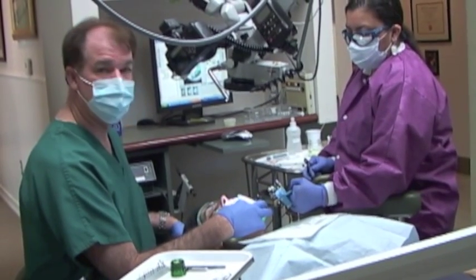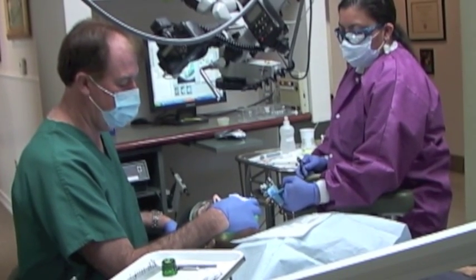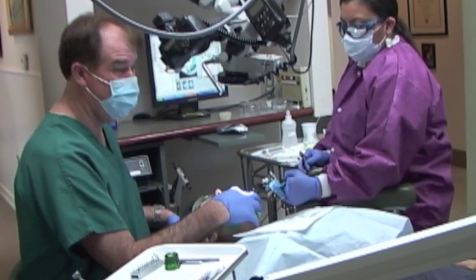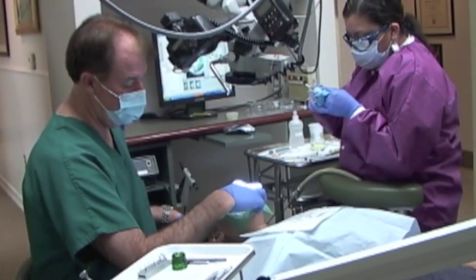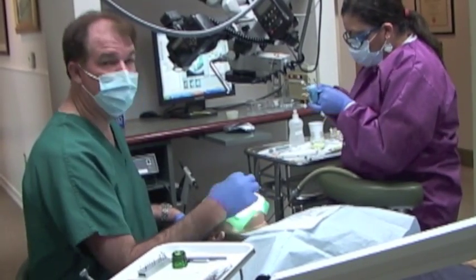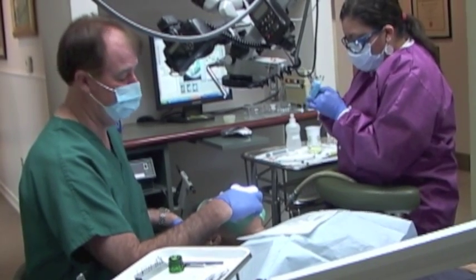I'm just teasing it with little rotational movements, very passively. Now I'm doing a filing motion, backing out over the bump, smoothing the bump. It happens to feel like it's about a millimeter from the tip. Now with the 25, same thing — it kind of goes over the little bump, which is a little bit smoother now.